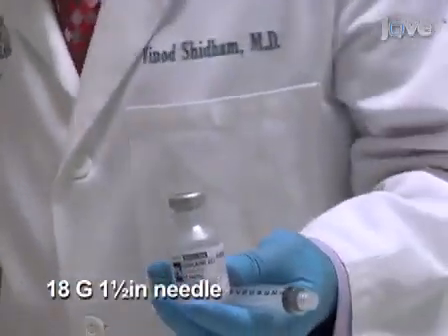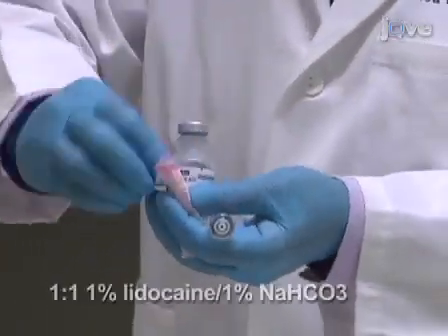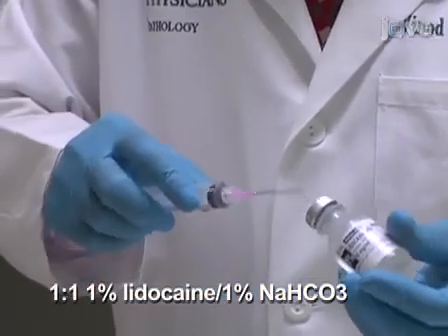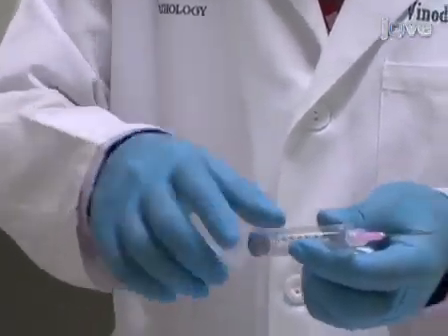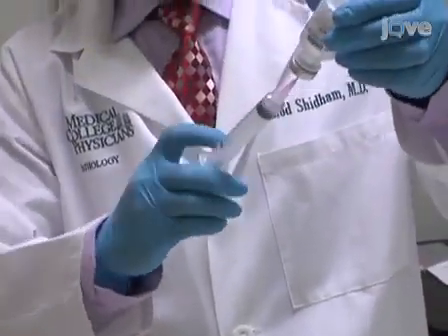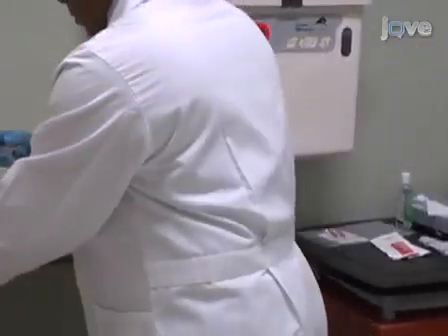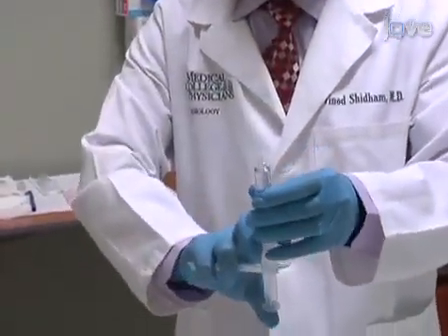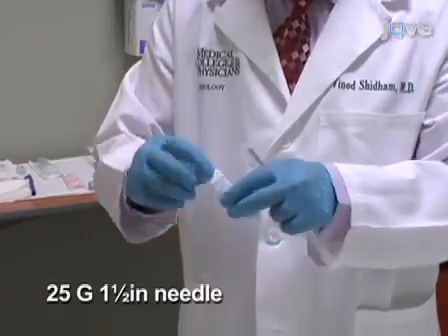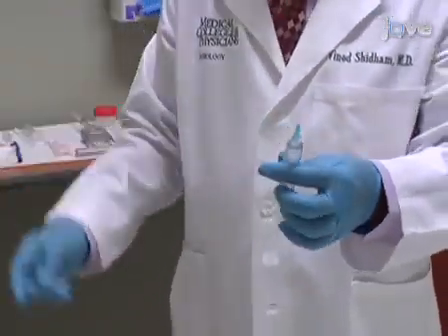Using an 18 gauge needle and a 10ml syringe, aspirate approximately 10ml of the 1% lidocaine and 1% sodium bicarbonate solution to use as a local anesthetic. Although 1% lidocaine may be used alone, the added sodium bicarbonate will prevent the initial brief burning sensation after instillation. Detach the lidocaine-filled syringe from the 18 gauge needle, then attach the syringe with a 25 gauge 1.5 inch needle. Holding the syringe upright, press the plunger and tap the syringe barrel to remove any trapped air.